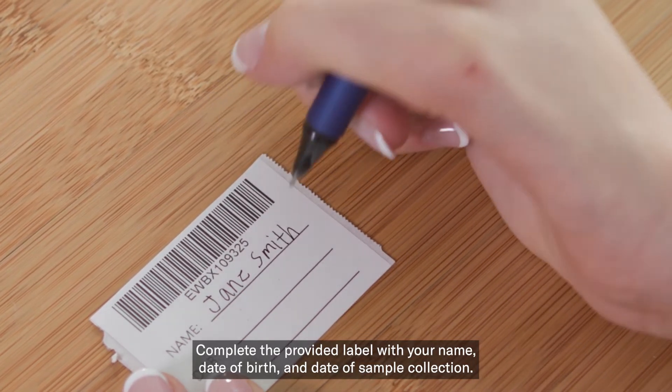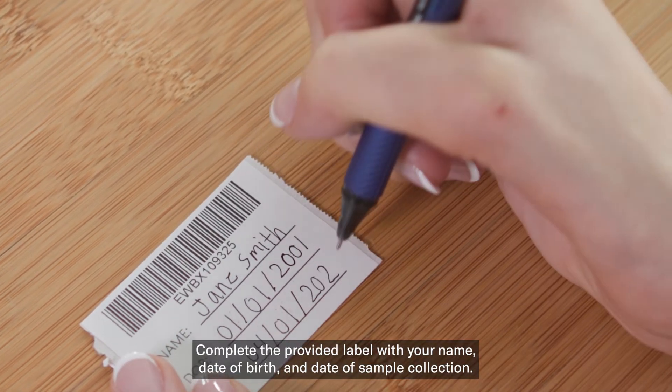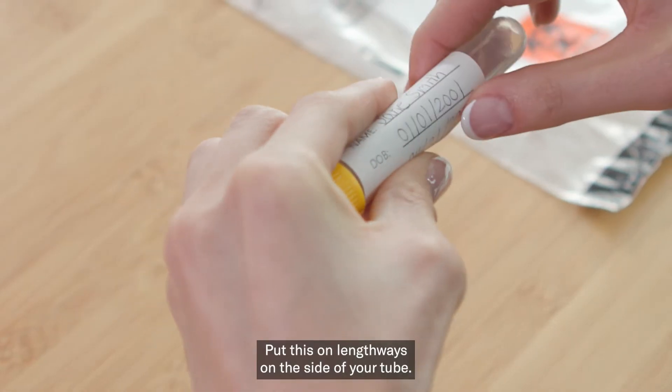Complete the provided label with your name, date of birth, and date of sample collection. Put this on lengthways on the side of your tube.